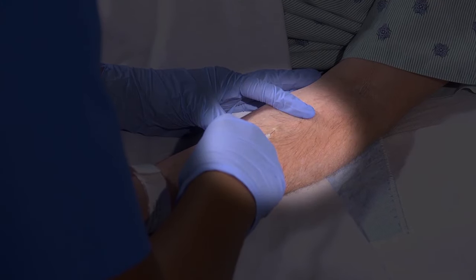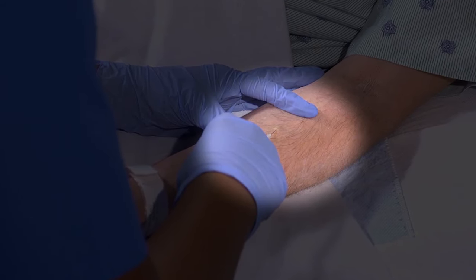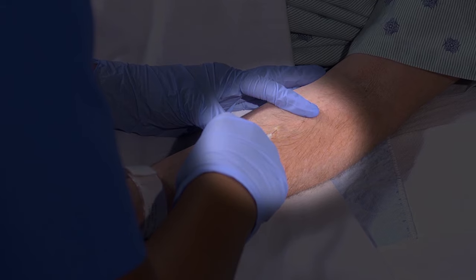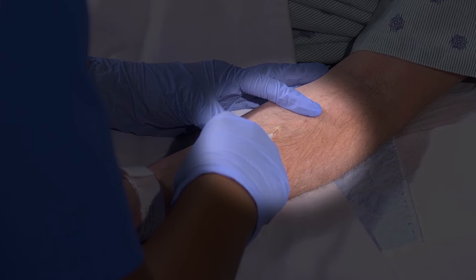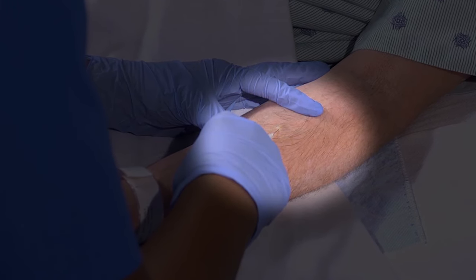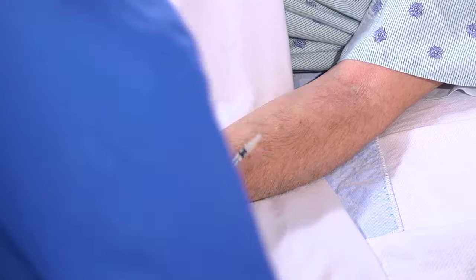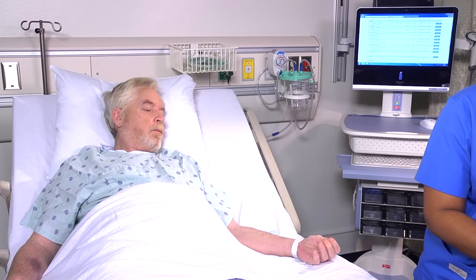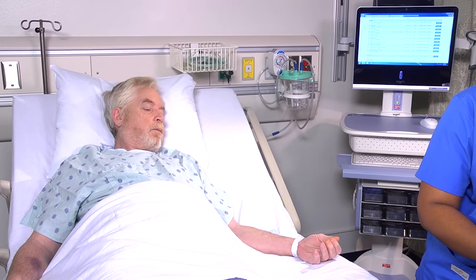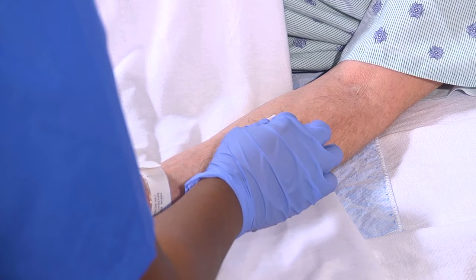As you inject the medication, a quarter-inch bleb that resembles a mosquito bite will appear on the patient's skin. After withdrawing the needle, gently wipe the site with an alcohol swab or gauze pad. Do not massage the area.